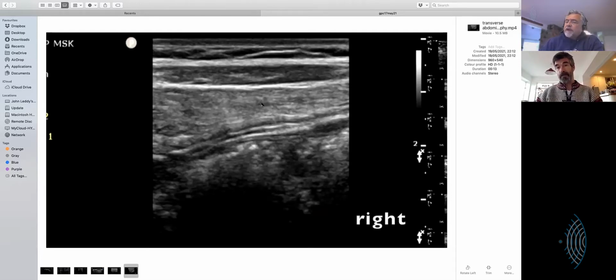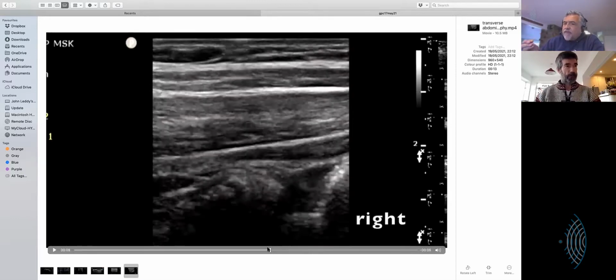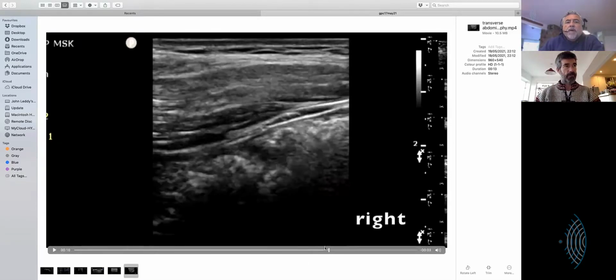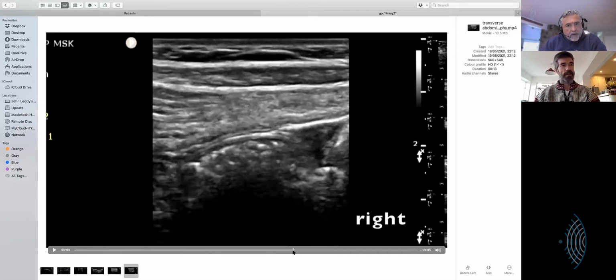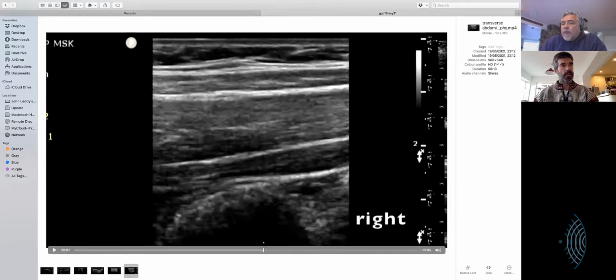So are you inferring it is neurogenic atrophy? Wow. Yep. There you go. See that? Just gone away. And the internal oblique is trying to as well. But see, so that's abnormal, back to normal. And so it's just scanning down and just goes normal, normal, normal, normal, not normal, and then normal again. And it must just be one level.